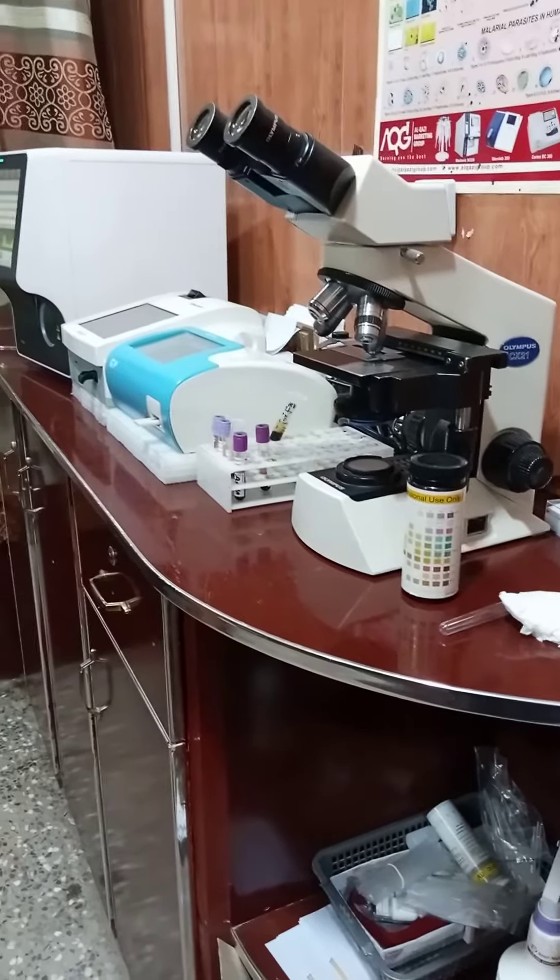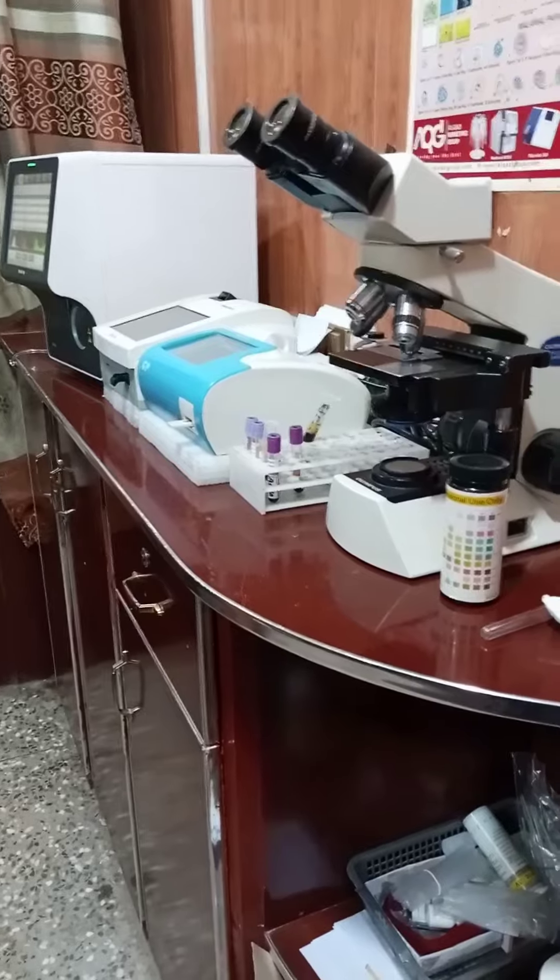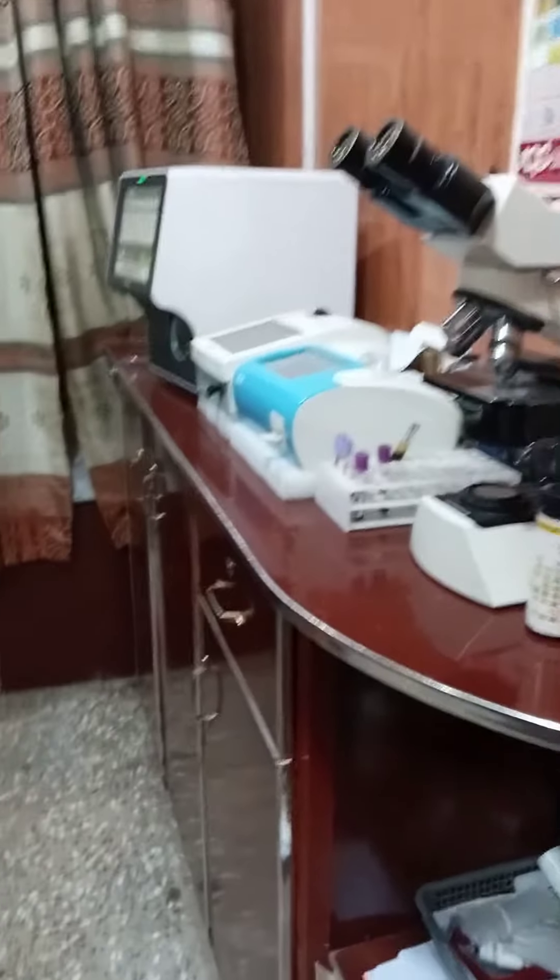Assalamu alaikum everyone. Today we are going to visit a clinical laboratory. In this clinical laboratory there are some instruments and machines that are used for diagnostic purposes.